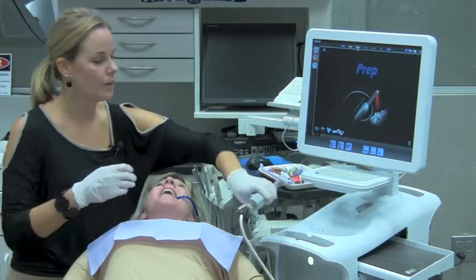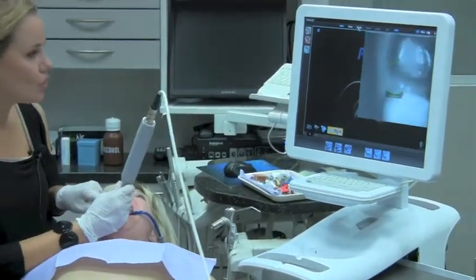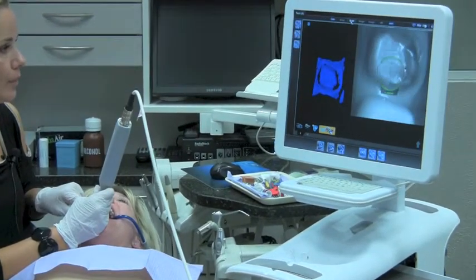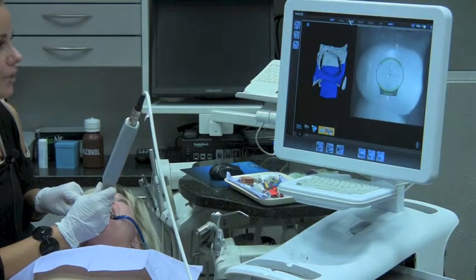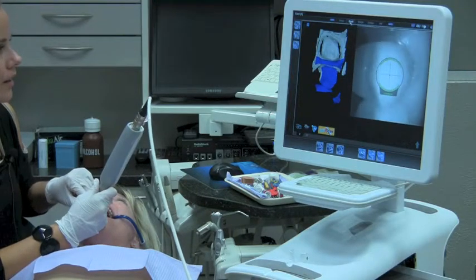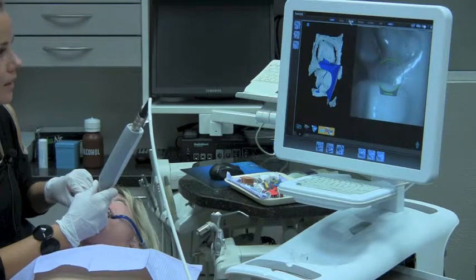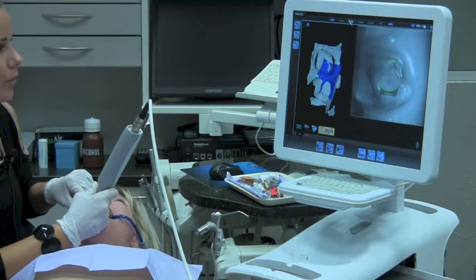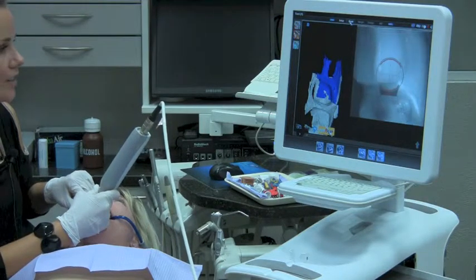I activate the camera and go into the mouth to start capturing. I'm going to start directly over the occlusal surface and move to the mesial, then capture my mesial neighbor. Now we're ready to start our rotations — rotating down the buccal aspect, capturing the interproximal, the buccal of the preparation, the distal interproximal, and now the distal neighbor.